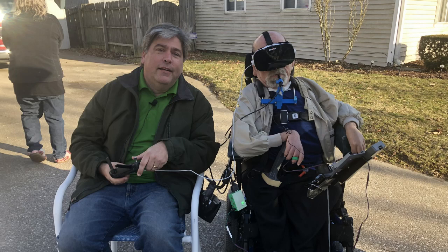The guy behind the goggles is me, Chris Young, and that's my friend Bill Benko from ATmakers.org. Bill has created a device that allows me to fly a drone using my wheelchair joystick. Here's how our first flight went.